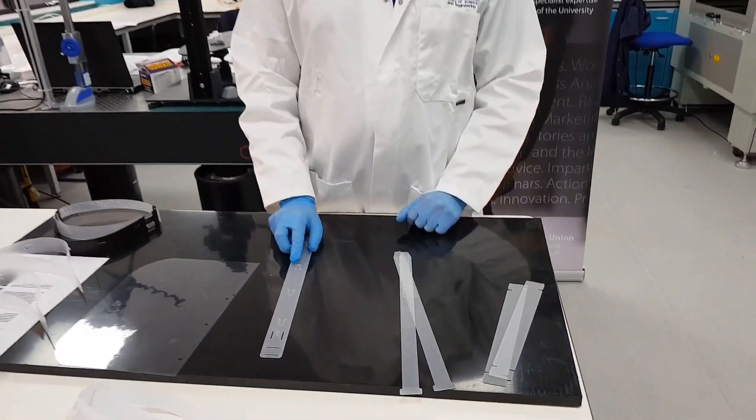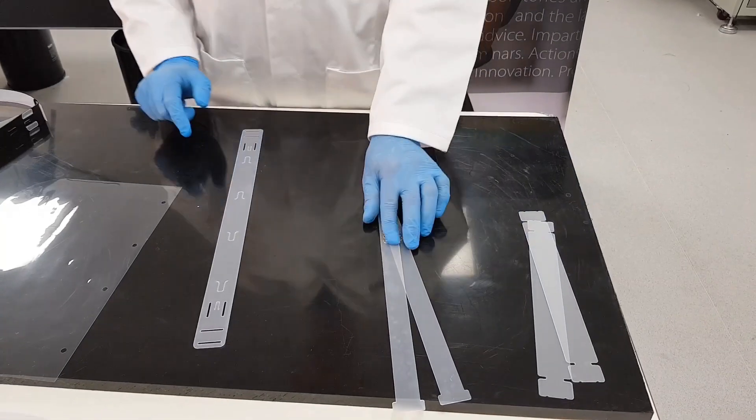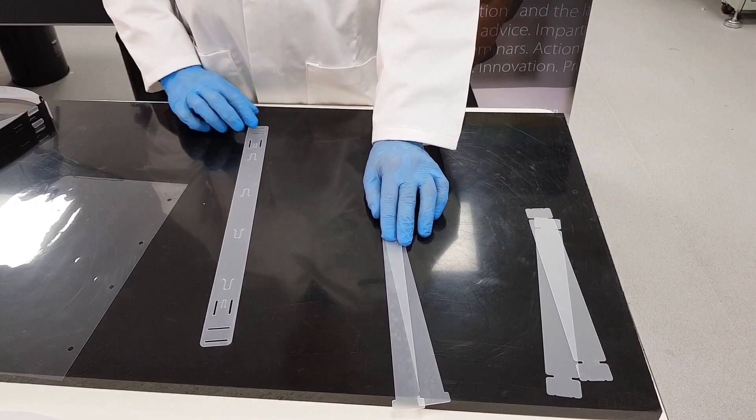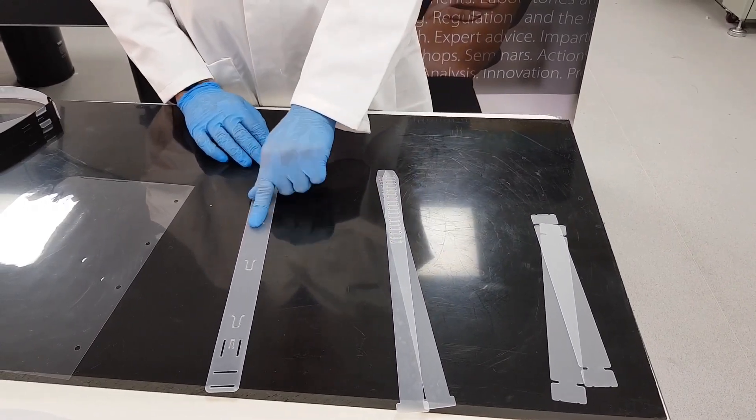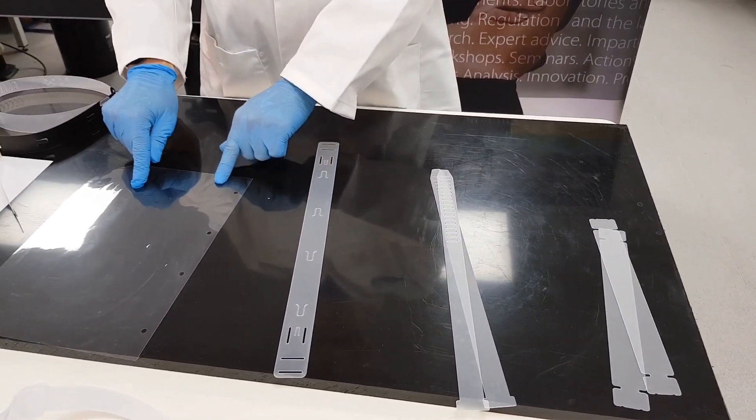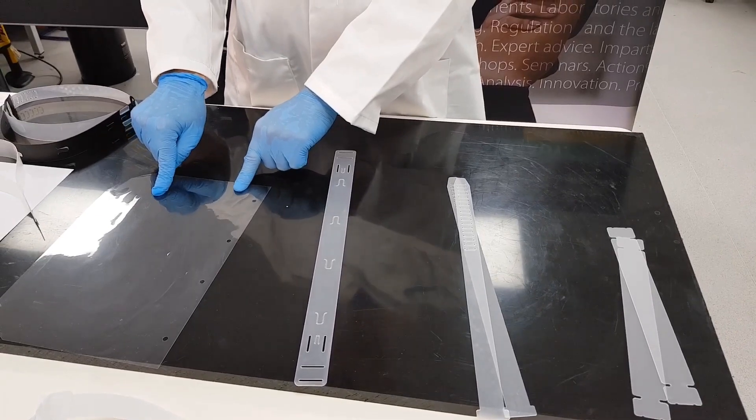There are three parts: the headband, the adjustable strap, and the fixing band. There is then a piece of acetate which we'll fix later.